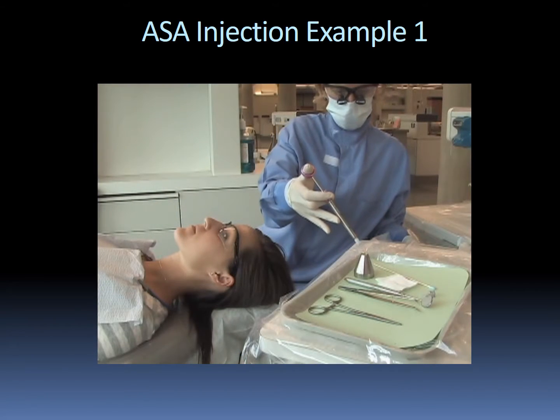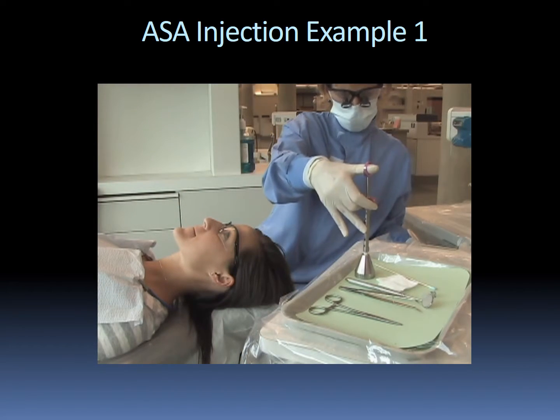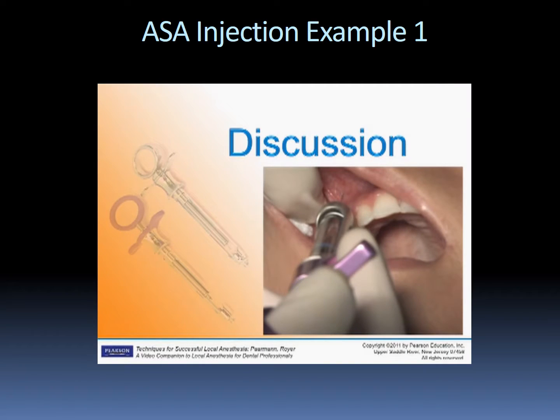Potential complications from this injection are minimal. There is the possibility of discomfort if periosteum is contacted. Be sure to stay parallel with the long axis of the tooth to avoid touching the periosteum. Ballooning of tissue may occur in this region. Also, it is possible to see some hemorrhage at the site of penetration.